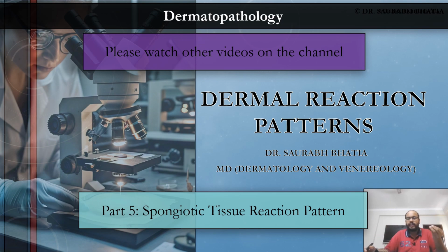So what essentially is spongiosis? Spongiosis is nothing but separation of keratinocytes because of edema, or fluid deposition, or extravasation of fluids, okay? And since we are talking about the microscopic level, you have to examine other sections so that you don't miss it, because sometimes the focus of spongiosis is not that thick. It's very thin. So you might miss it in one or two sections, and you just have to examine multiple sections to find out the real extent or the presence of spongiosis.